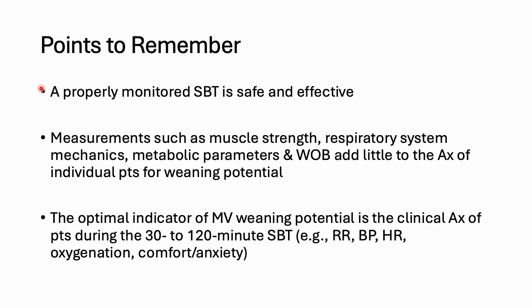Okay. So some points to remember about weaning of mechanical ventilation. A spontaneous breathing trial is safe and effective in determining whether the patient can be weaned off mechanical ventilation. It also tells the team whether the patient can breathe on his or her own when the mechanical ventilation is removed. You may also do other assessments, but research has shown that a lot of other measurements may not add a lot of value in terms of assessing whether the patient has weaning potential.